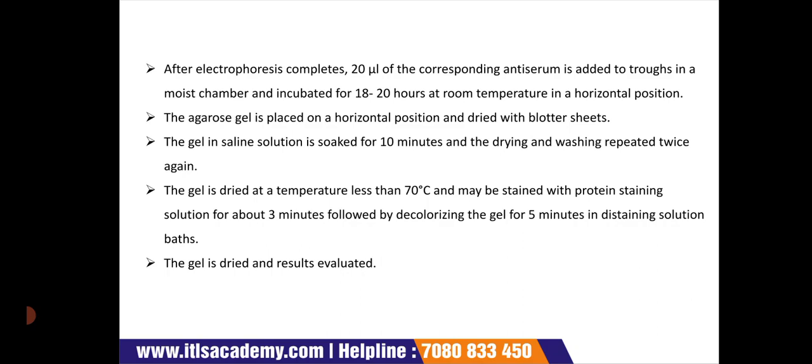You must be aware of the temperature at which the gel is dried, that is 70 degrees centigrade. You must be aware of how many minutes the decolorizing of the gel takes, that is 5 minutes. You must be aware of all these things whenever you are revising this PPT.